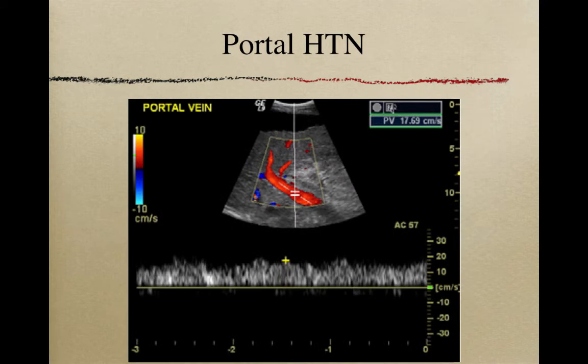And that's measured by ultrasound as Doppler flow, which goes towards the ultrasound probe. So here's the ultrasound probe face here, and this is going to be Doppler flow that's going towards the probe. Here's our scale on this side, and what we see here is red flow. Red to yellow flow is flow that's moving towards the probe, and then blue flow is flow that's away from the probe. And so we can see this is blood normally flowing into the liver, and we can actually see a little Doppler gate here with pulse wave Doppler, and we're also measuring venous flow going towards the liver.